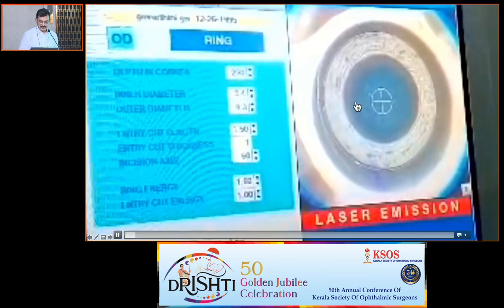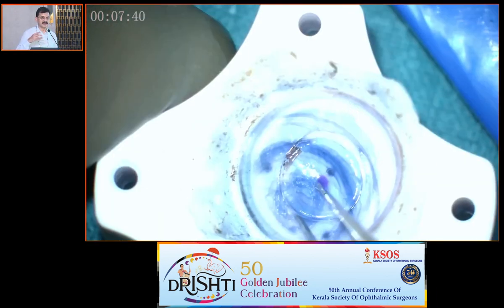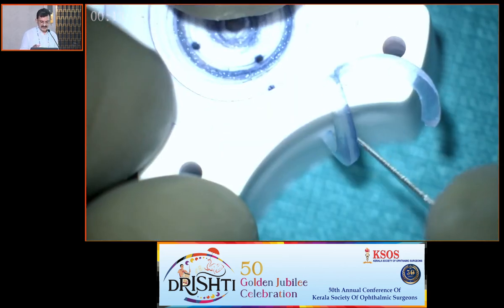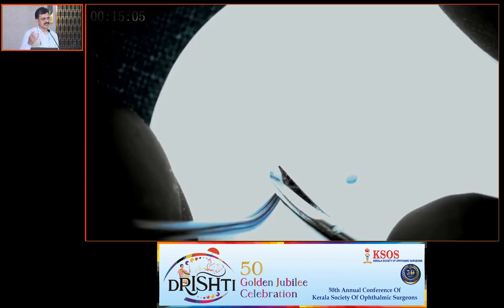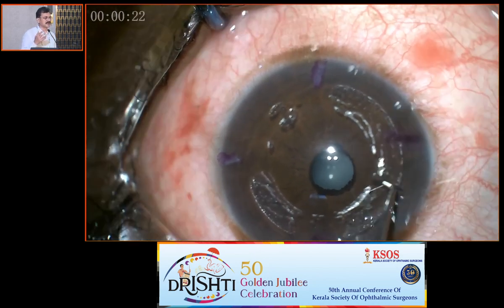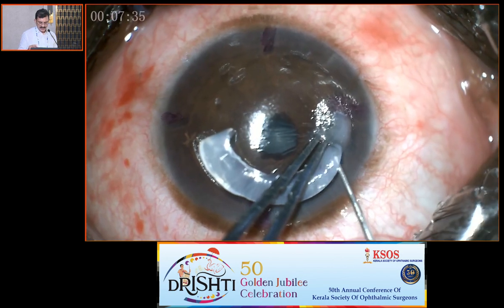So we again make the pocket with femto laser, somewhere between 5 to 6 millimeter, 8, 9 millimeters pocket. Then we fashion the graft. We can fashion it ourselves depending upon the topography. You can fashion different shapes, different thickness, and different sizes. So that is the advantage when compared with intacs. Intacs are fixed sizes. Here you fashion them and you insert them.